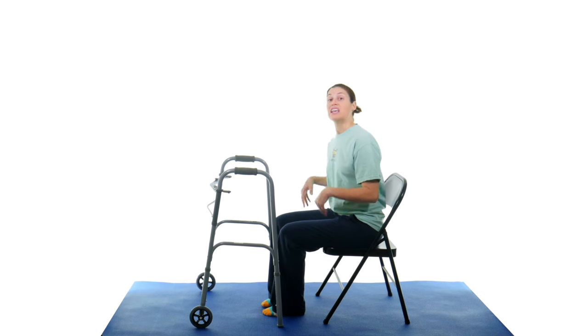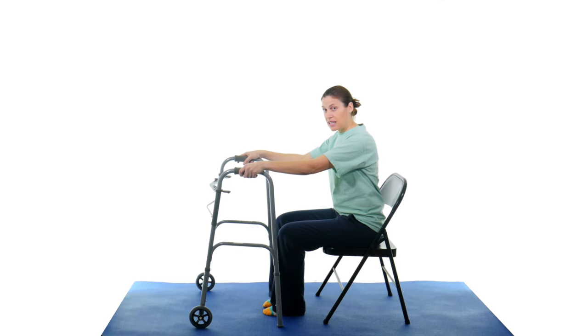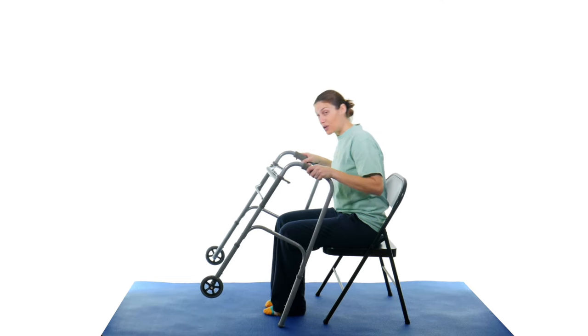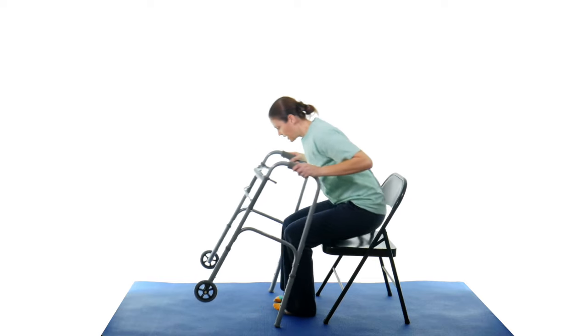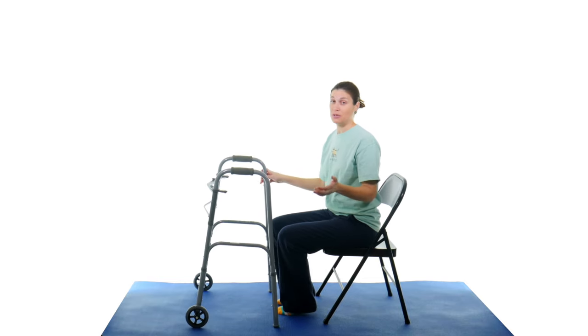So the biggest thing with getting up and getting down using a walker is to make sure you're doing it safely. A lot of times this is what I see people try and do, and it's really kind of a bad situation because it's going to make it really hard to get up. It might even make people fall. People will grab their walker like this and try and pull on their walker to get up. So they're trying to do this and then they're just going to plop right back down. So that's kind of almost impossible to do.